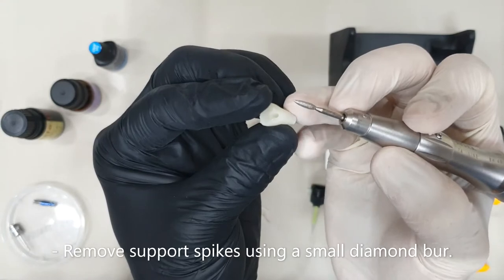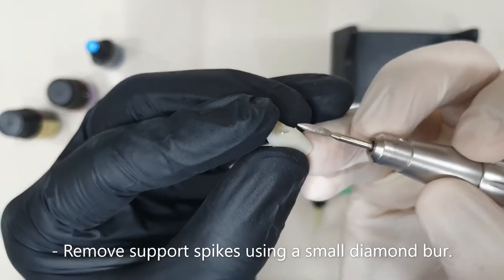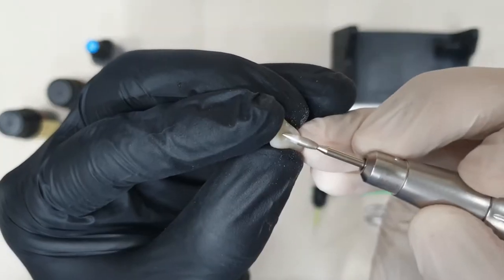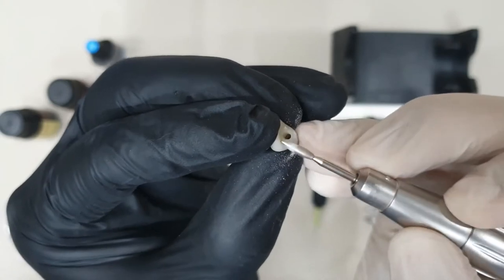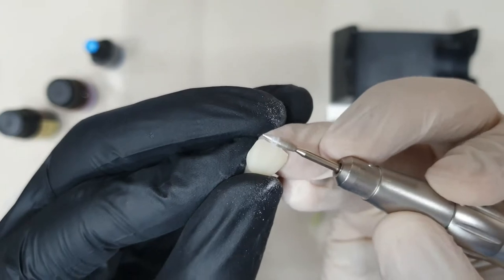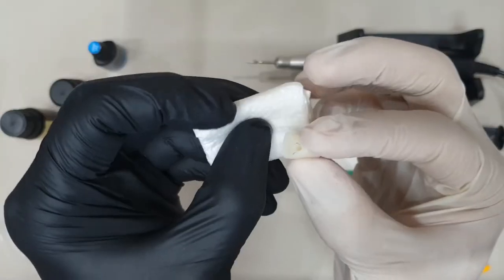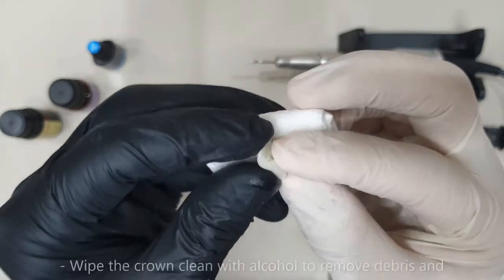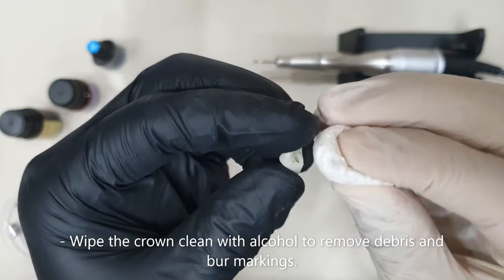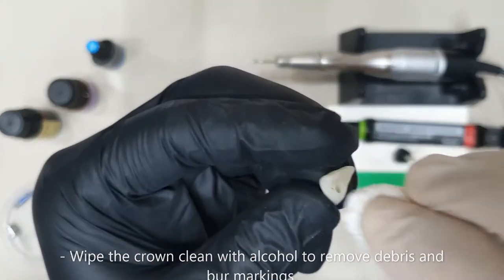Now I'll start to use a diamond burr and I'll make sure that I remove these little spikes that resulted from the removal of the supports. After smoothing the crown, I'll get a piece of gauze with a little bit of alcohol and wipe my crown just to get rid of any markings.